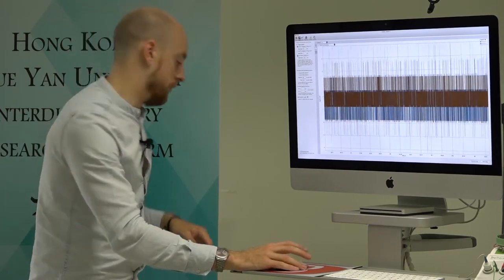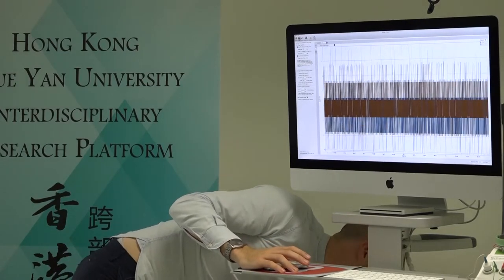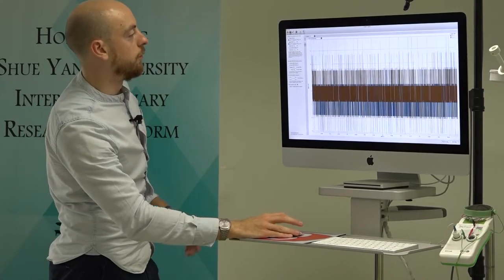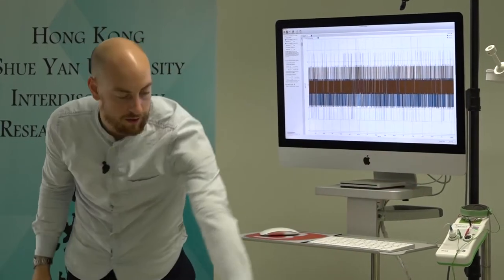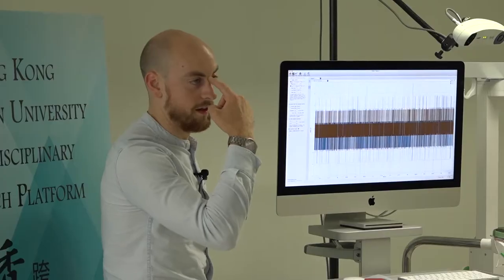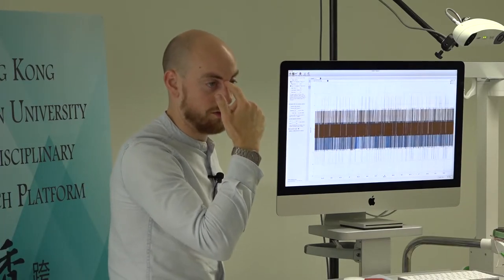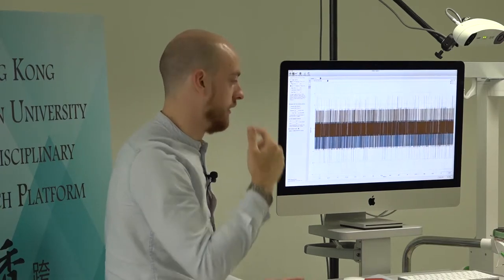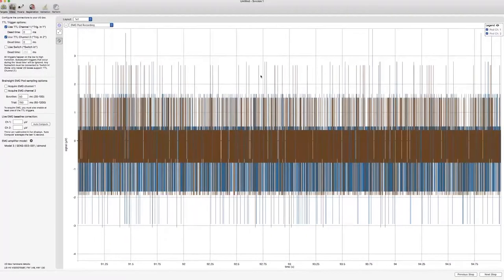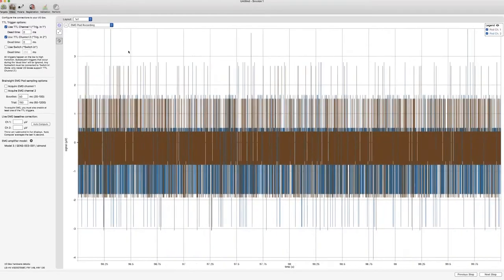So we've got the foot switch turned on as well. The foot switch is coming in on TTL1 and TTL2. So we're using TTL1 as a stimulator, TTL2 is the foot switch. We're going to use that in a second: when I use the pointer on the Nasion, I'm going to press the foot switch and it'll say, okay, I know that the pointer's there, instead of me pointing there and then clicking around with the mouse. It's nice to have that because you can be next to your subject and in the right place.